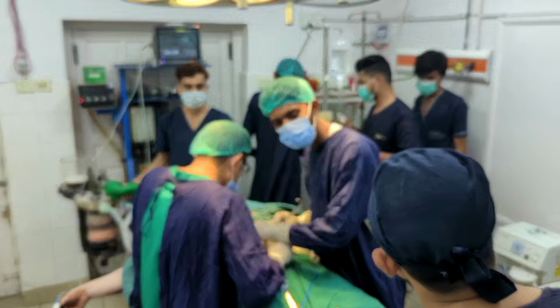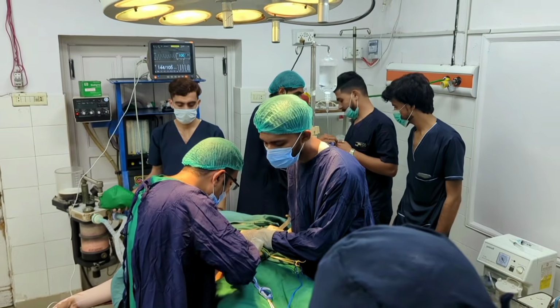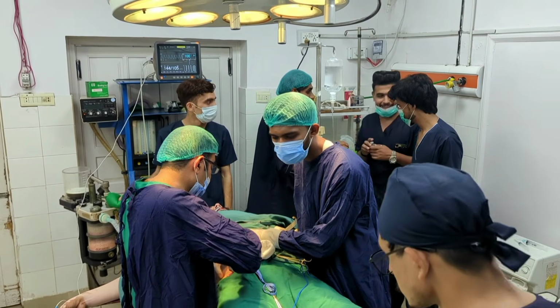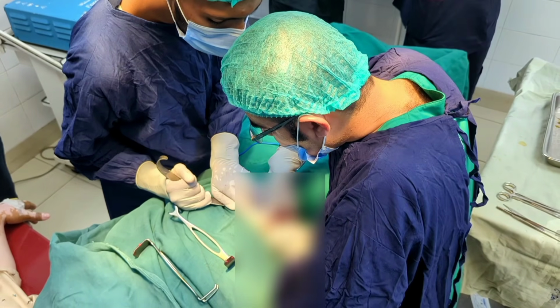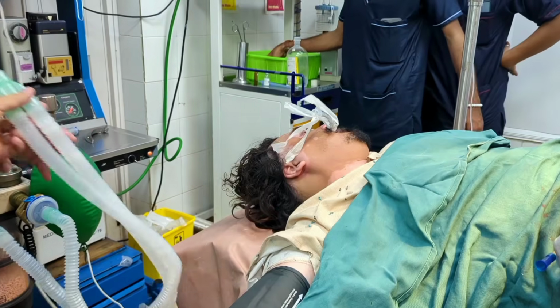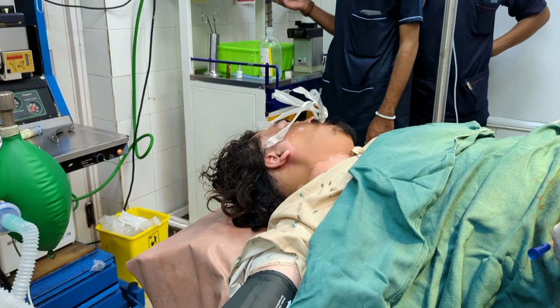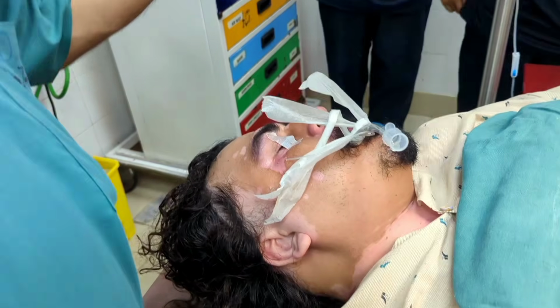The appendix is a small, tube-like structure attached to the large intestine, and in many cases, it can become inflamed or diseased. In this patient, it was decided to remove the appendix to prevent any future complications. The base of the appendix was secured. After the completion of the surgery, the patient gradually started to regain spontaneous breathing.